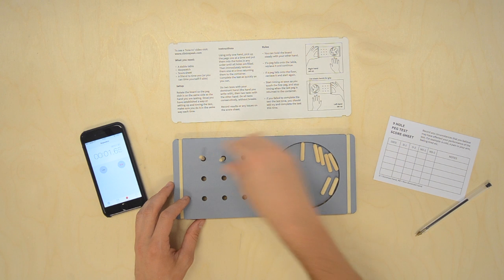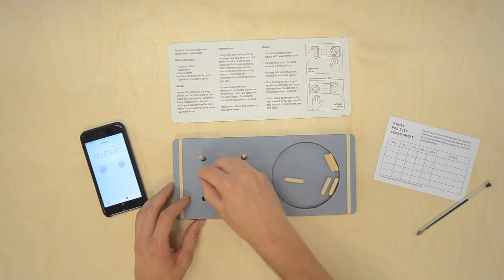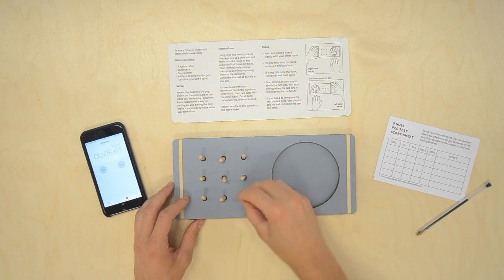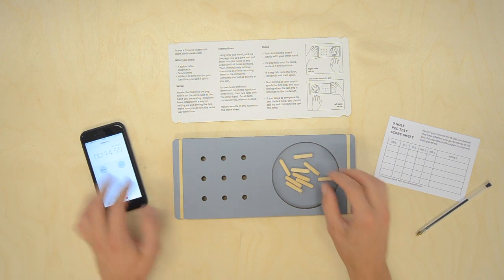Using only one hand, pick up the pegs one at a time and put them into the holes in any order until all the holes are filled. Then immediately remove them one at a time, returning them to the container. Complete the test as quickly as you can.